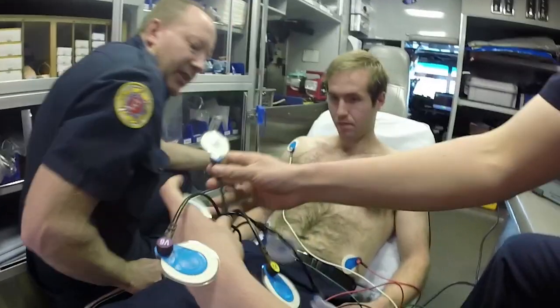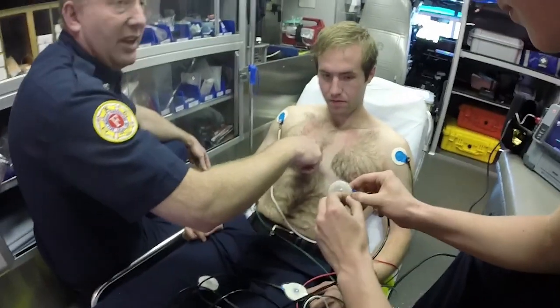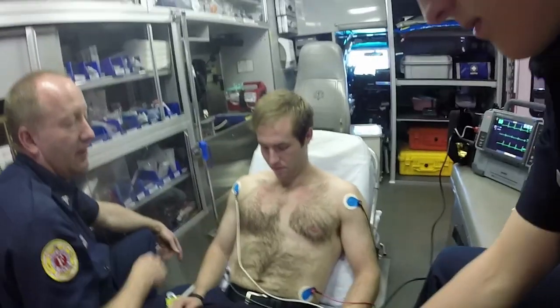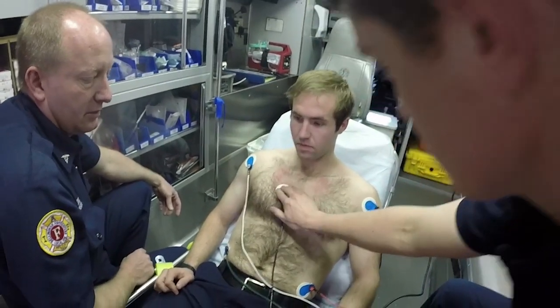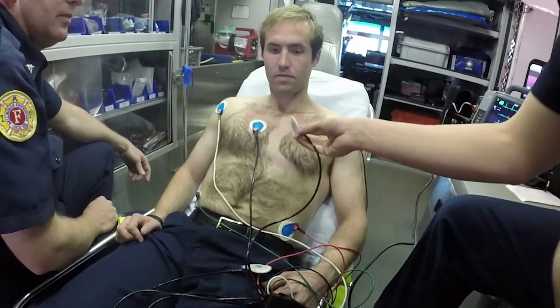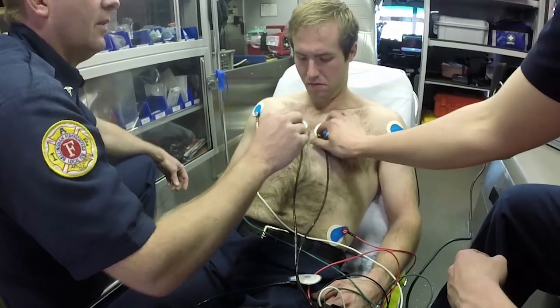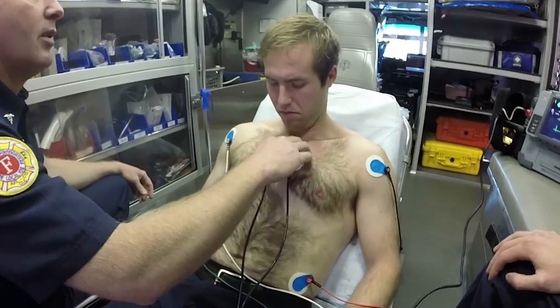So we have V1 through V6 on there, V1 being our first placement, which is going to be that fourth intercostal space. I could feel it right here, so that's the center of your blue dot, should be right there. And V2 is just exactly opposite that one, just a little lower — maybe a smooch lower, but it's okay.